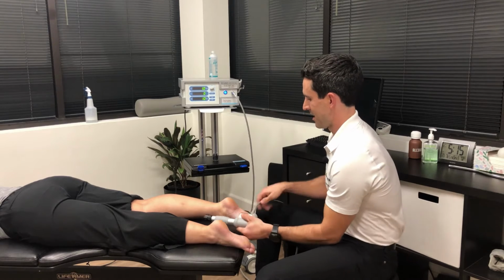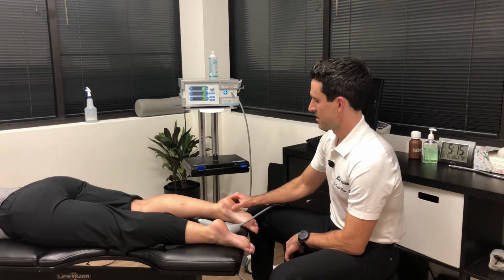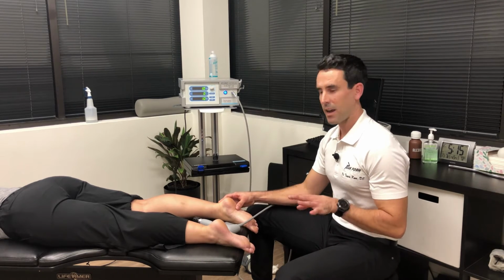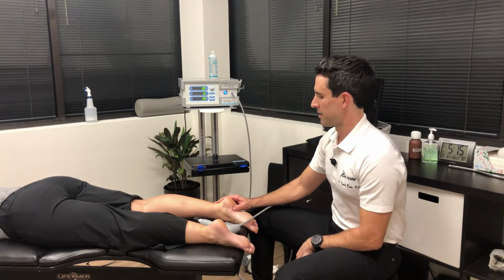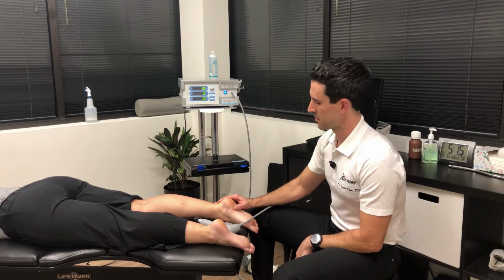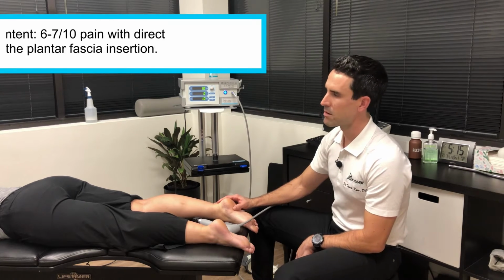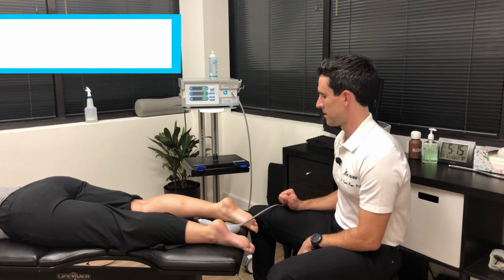All right, and just to see where we're at today, Sarah said that her pain level on a day-to-day basis is about 5 out of 10, and by the end of the day might get to 6 or 7 out of 10. And just pressing in on the heel into that insertion, how painful is that, Sarah? 7, maybe 6. Okay, so 6 to 7 out of 10, just with some pressure right into the insertion point of the plantar fascia.